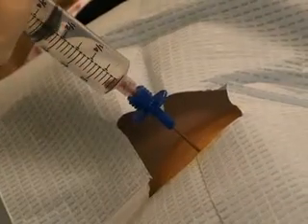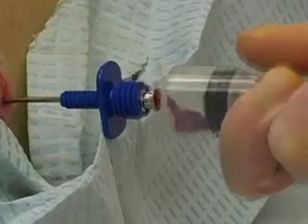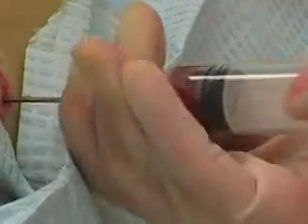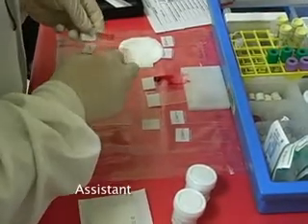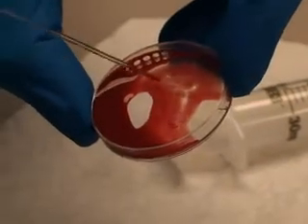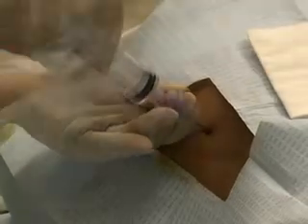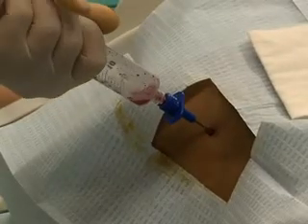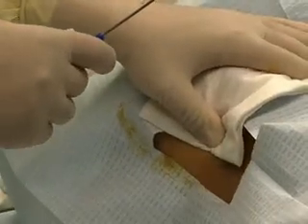Once the needle is through the cortex and the marrow cavity is entered, the needle should stay in place without being held. Next, remove the stylet. Attach a 30-milliliter syringe without heparin and aspirate 1 milliliter of marrow with a firm pull. Since the aspiration itself can be particularly painful, it is prudent to warn the conscious patient before you aspirate. Note that you may hand a syringe to an assistant or pathologist, taking care to maintain sterility. The non-heparinized aspirate should be used to prepare specimen slides. Adequacy of the specimen can be verified by the presence of bony spicules in the sample. Next, aspirate marrow into syringes containing 1 milliliter heparin as needed for diagnostic tests. Remove the aspiration needle and apply pressure with sterile gauze until you are ready to perform the biopsy.